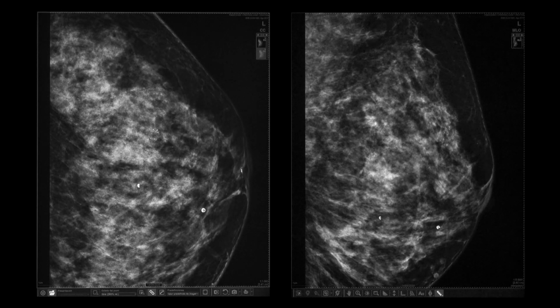In the craniocaudal view, draw a straight line from the nipple to the chest wall. This is 4.38 centimeters, and a perpendicular one from the lesion to intersect with the first, which is 1.31 centimeters. These measurements will be replicated in the breast to ease positioning.